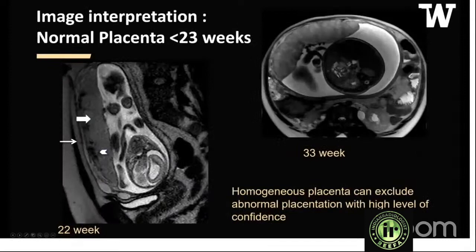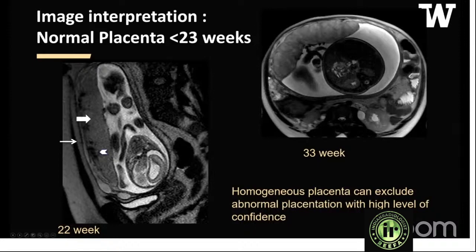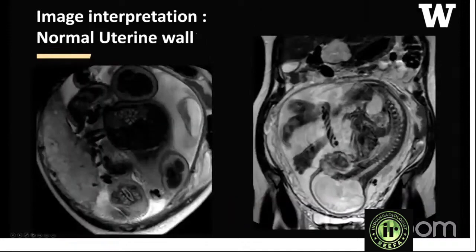A normal placenta is homogeneous. At 22 weeks it has a uniform appearance — the dark areas along the periphery are small vessels, not T2 dark bands. At 33 weeks, homogeneity decreases and the placenta appears more heterogeneous. A relatively homogeneous placenta can exclude abnormal placentation with a high level of confidence. The uterine wall is normally dark on T2-weighted images, though it can appear mildly hyperintense if there are many vessels within it.